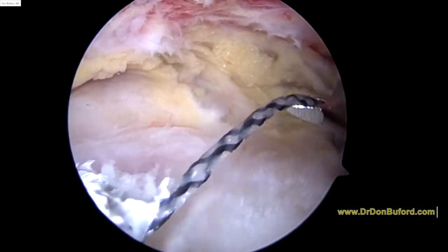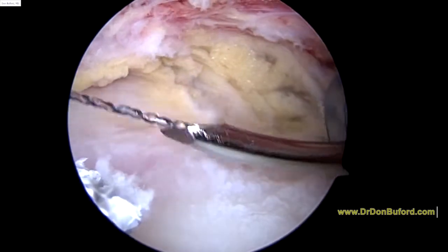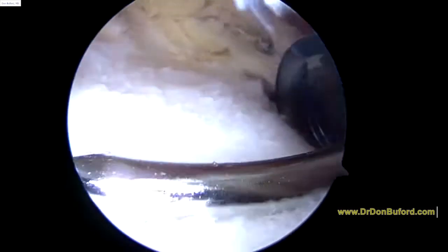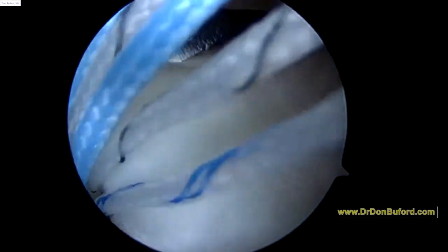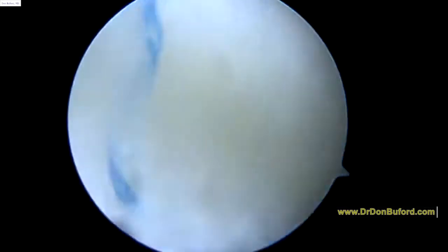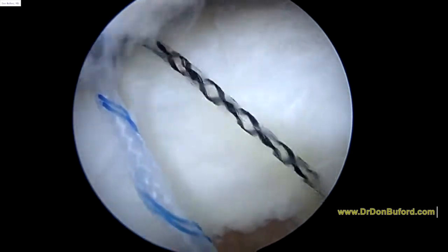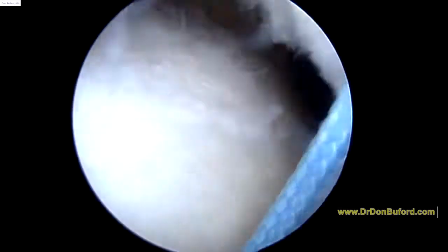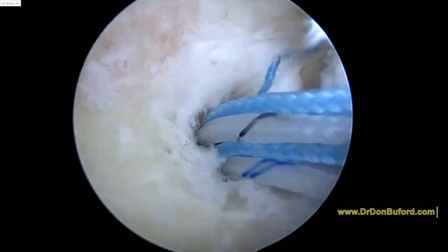The instrument that you see here is called a suture hook. It's loaded with a black wire that we call a super shuttle. You can see it there. And we're going to take this hook and pass it along this path right here. We're pulling back on the super shuttle. If you watch slowly, see how it brings that with it. And then it comes out over there. We're going to use what we call a turn to the left next. So we pull tight, and that's going to bring that suture all the way underneath.